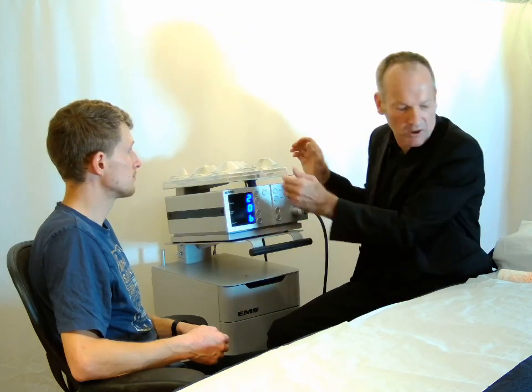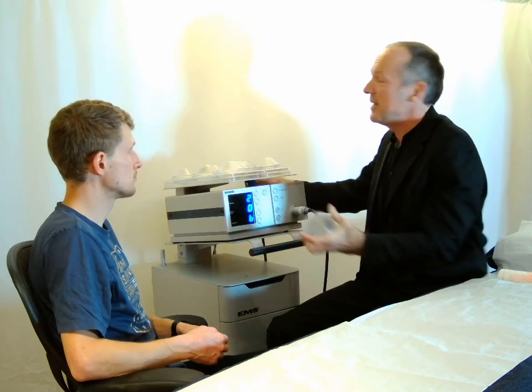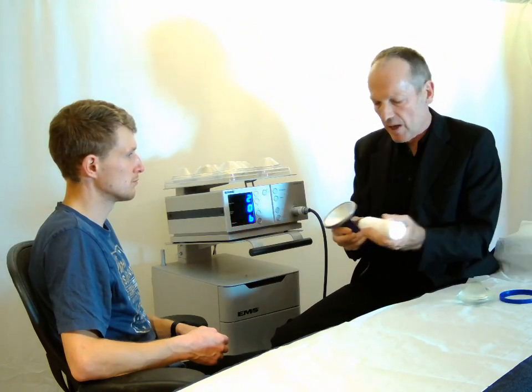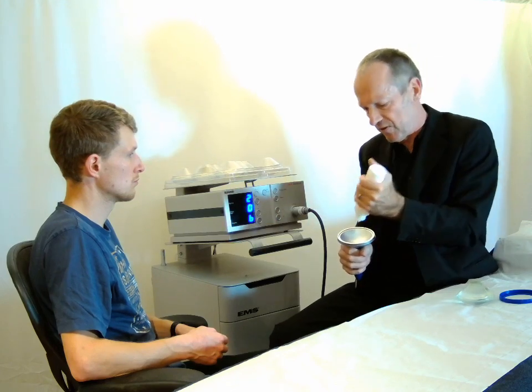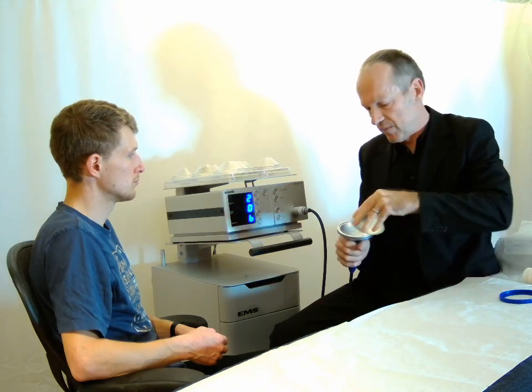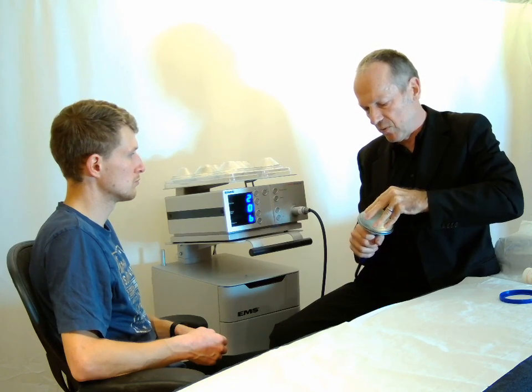The first important factor with focused shockwave therapy is understanding the depth that one is treating. So we're going for a superficial penetration. We're using the most superficial of the attachments here, which is going to give us a 5 millimeter cavitation. So we'll apply that now. And first treatment, I'm looking to hopefully achieve 2,000 pulses. I tend to use a frequency of 6 Hz simply because we find that 6 Hz gives a reasonable speed of treatment, but the actual shock wave is really able to form properly.